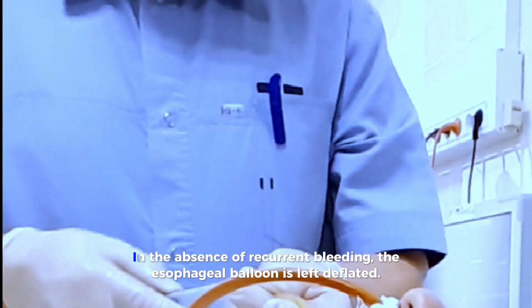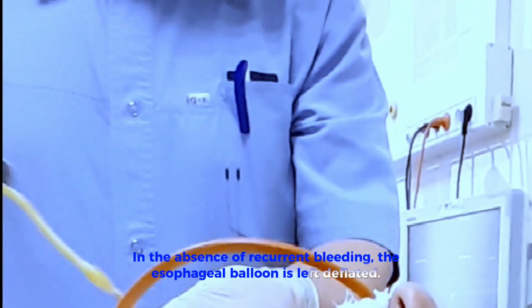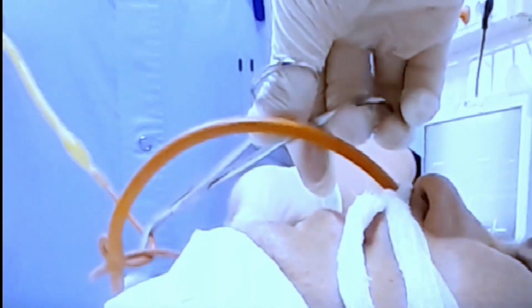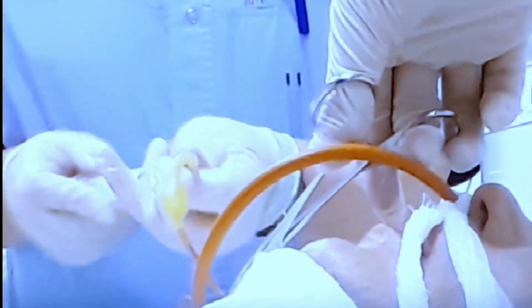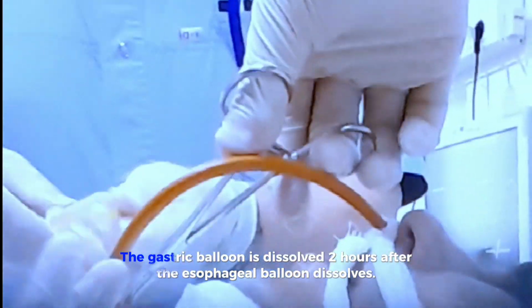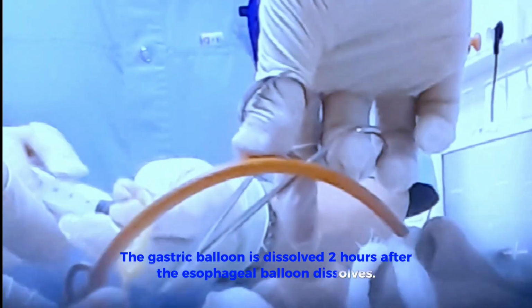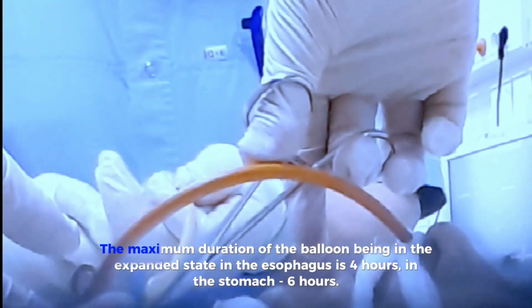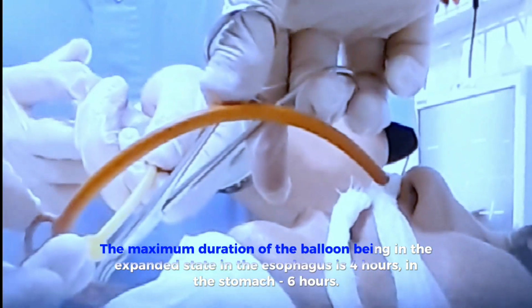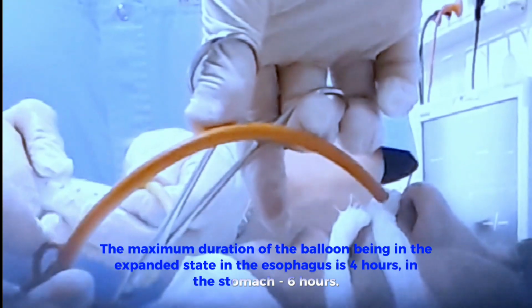How long can a Blackmore probe last? In the absence of recurrent bleeding, the esophageal balloon is left deflated. The gastric balloon is deflated 2 hours after the esophageal balloon. NB. The maximum duration of the balloon being in the expanded state in the esophagus is 4 hours. In the stomach is 6 hours.